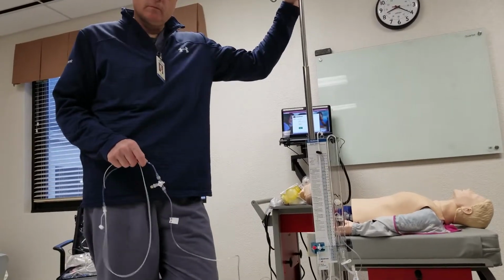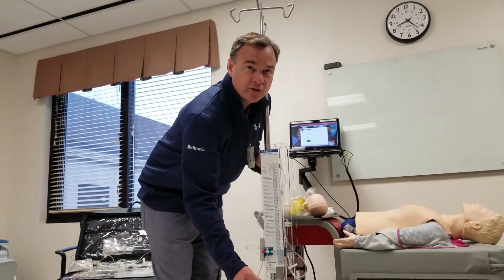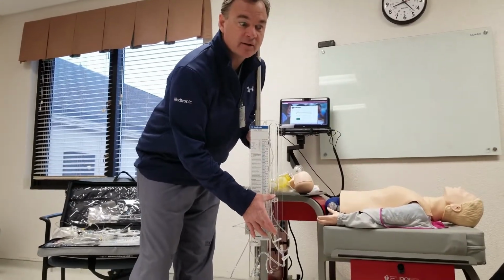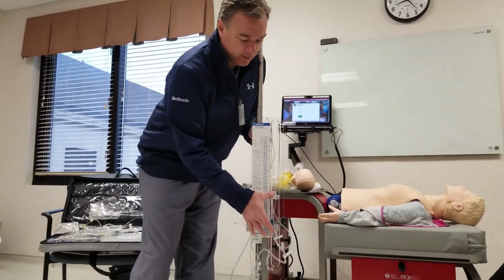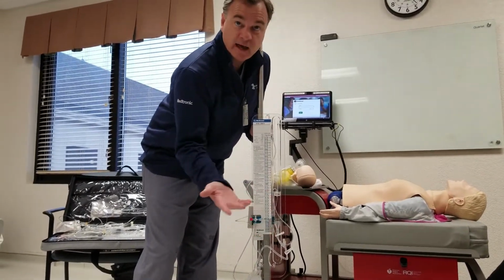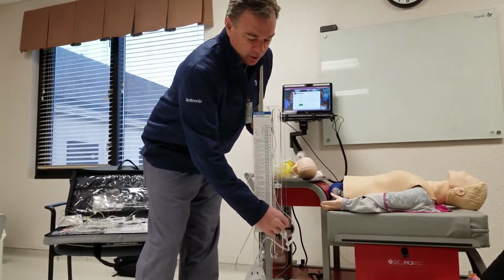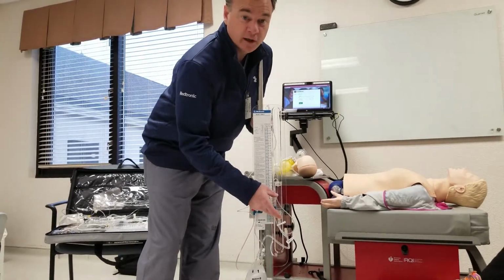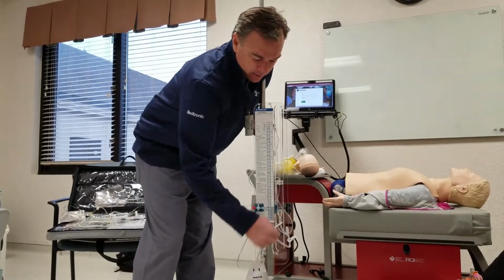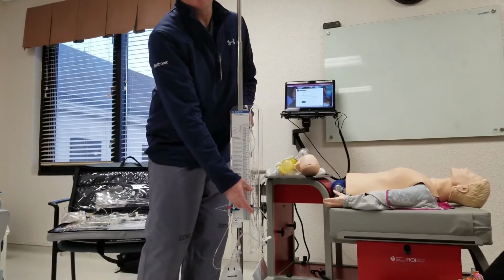So the intervention is still the same. You don't have to do any math of, oh, wait a minute, at the start of my shift I have to look back through nurses' notes, whatever timeline you're managing this in, 4 hours, 8 hours, you just fill this chamber up. When it gets to the time you're going off shift and you have to transfer over the patient and give report, you're going to say, okay, we're at 40, whatever amount it is. Clear this out, open it up, gravity's going to push it all the way down into the bag, close it back off, and now you have a graduated cylinder that's back at zero, right?